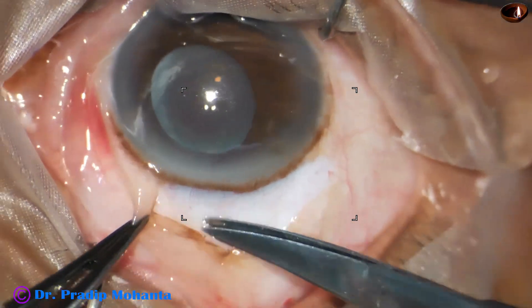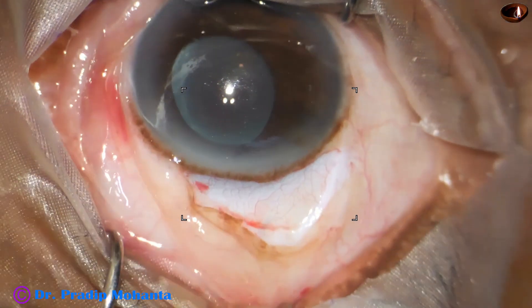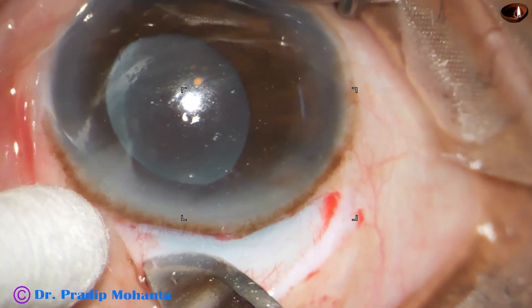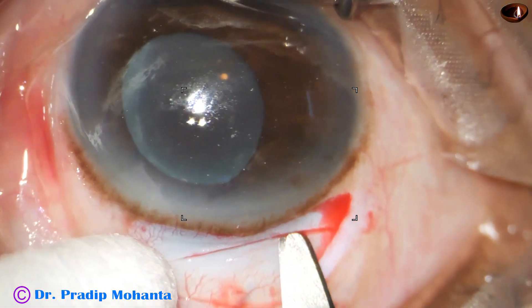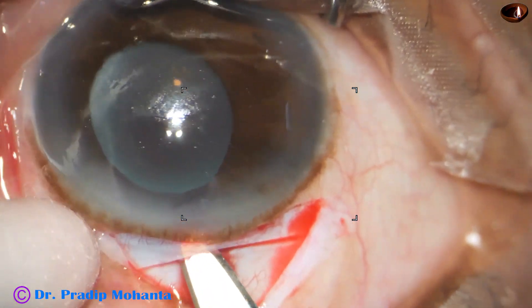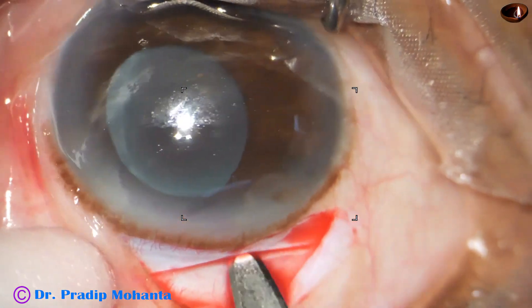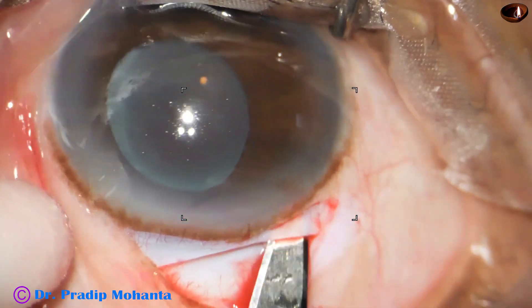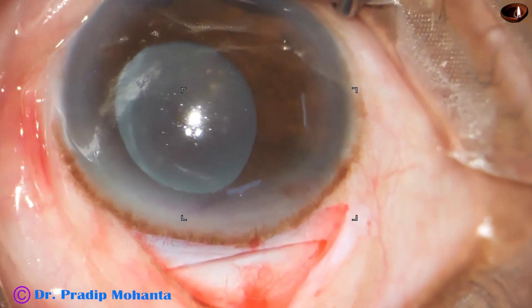I have planned to remove the lens in toto without cutting it, so I am making a sclerocorneal tunnel of about 6 mm — just like a SICS-style sclerocorneal tunnel of 6 mm or maybe 5.75 mm. I have not measured it; this may be even 5 mm. Making the sclerocorneal tunnel, we have to do a very neat tunnel, a very nice corneal valve, then we can avoid suturing this wound even though we may have to do vitrectomy in such cases. But it is recommended that you put one or two sutures to oppose the wound margins nicely.